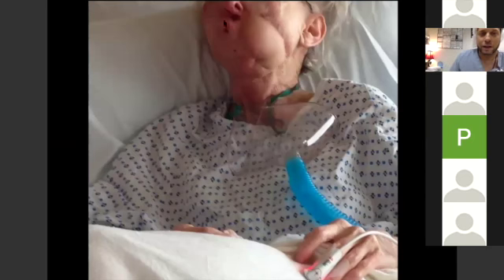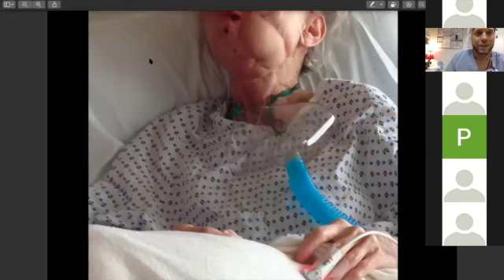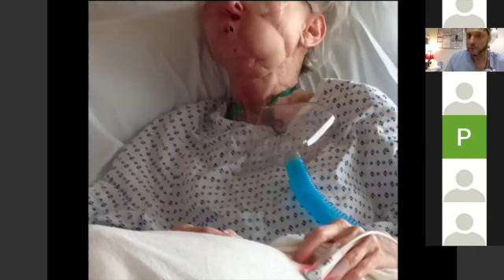This is a patient at our facility as well, status post head and neck cancer, multiple surgeries, flaps, radiation. They came to the operating room for tracheostomy. And as you can see, there is no mouth orifice, right? What's your anesthetic plan here? Say, well, I'll go nasal fiber optic. Well, we have normal tissues in our body before radiation, but after radiation, those tissues change. The elasticity that you have in your tissues, you lose that after radiation, becomes fibrotic. And instead of giving and stretching, tissues tear. So the mucosa becomes very friable.